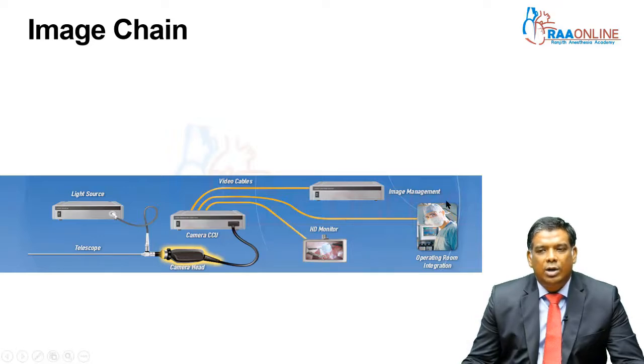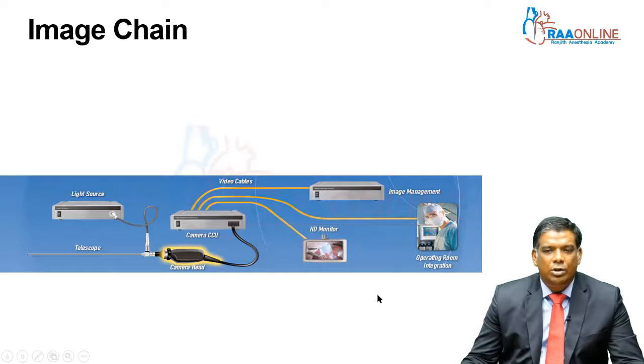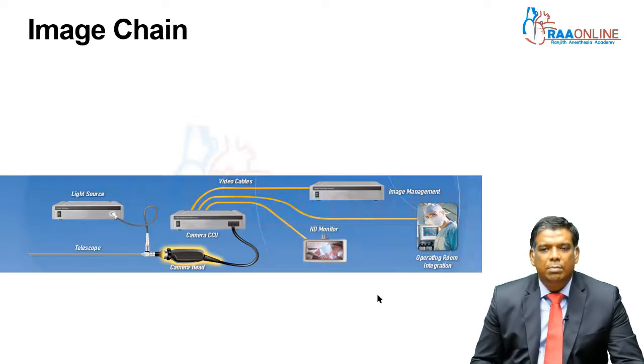And three, a dedicated OR setup where you have operating room integration, which can be used for relaying surgeries to your students, to a conference center, for webinars. But this is something which is very expensive and not usually present in many centers.